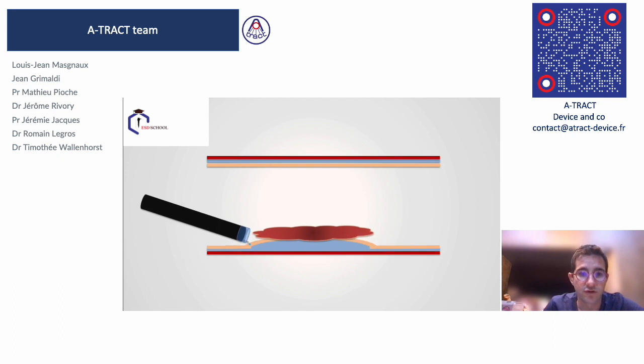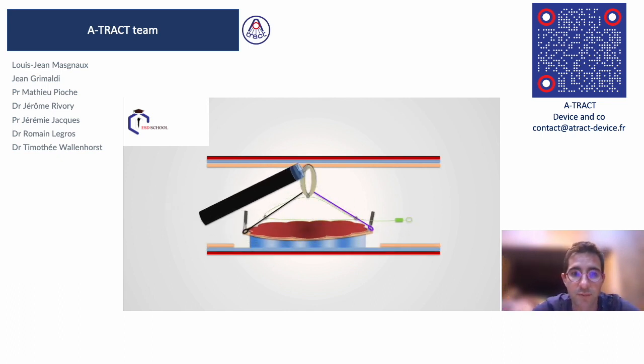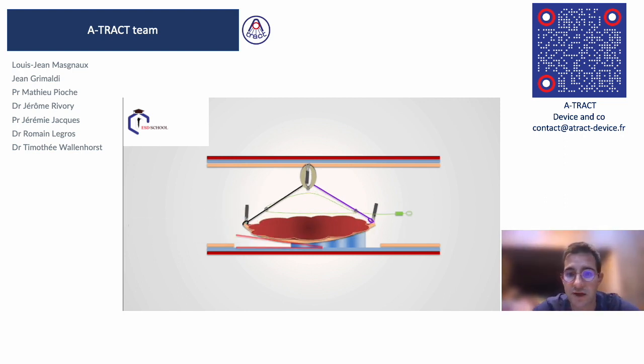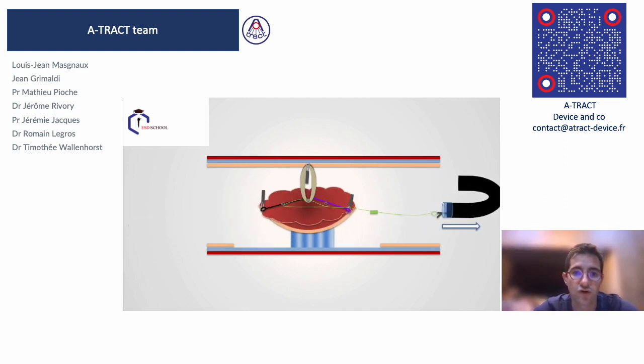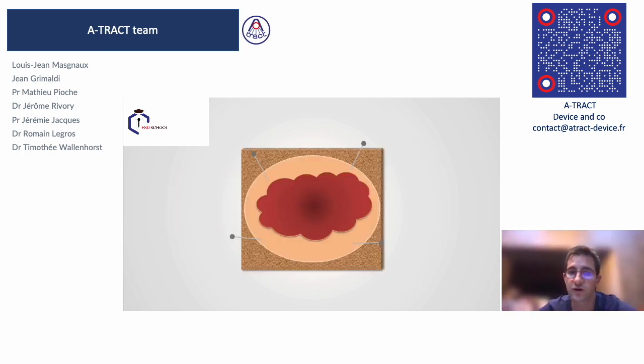So I hope this procedure was nice for you, and you could learn some points in a real clinical case. You can see all the different episodes about injection, incision, trimming, traction, everything, management of adverse events, but we will also try to give you some complete procedure in order to have also the whole procedure, and to be used to the strategy from the first to the last fibers.